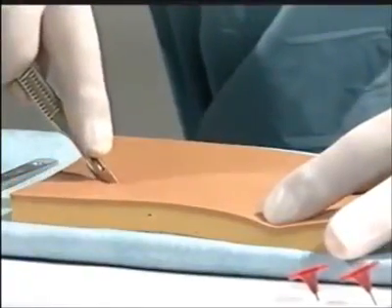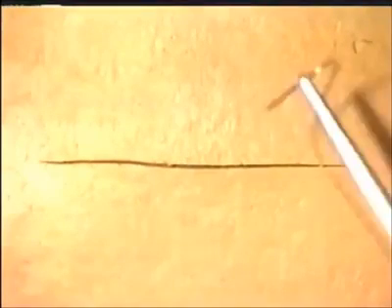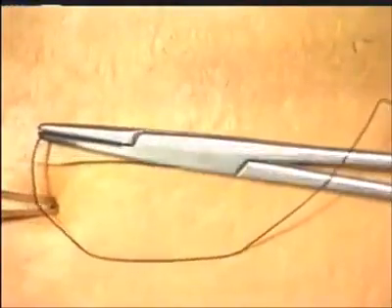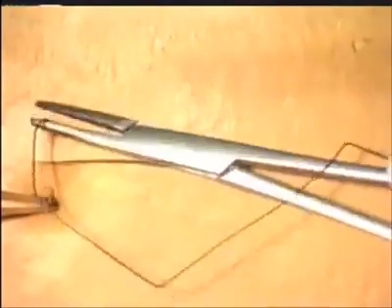Begin by making an incision in the simulated skin pad provided. We will now close this with interrupted sutures. Take a suture in your needle holder and insert the needle at right angles to the incision using counter-pressure from the forceps.